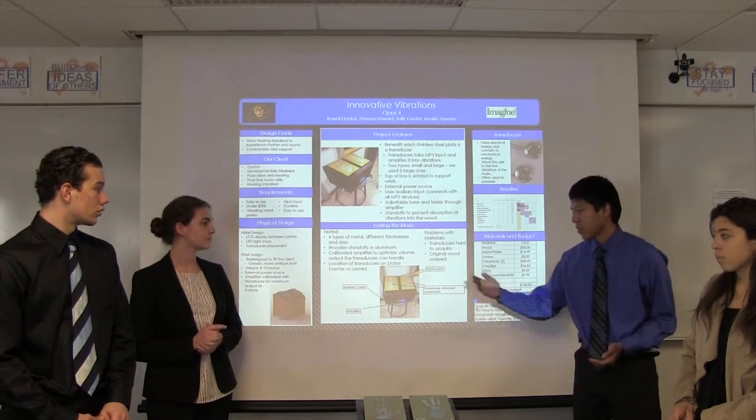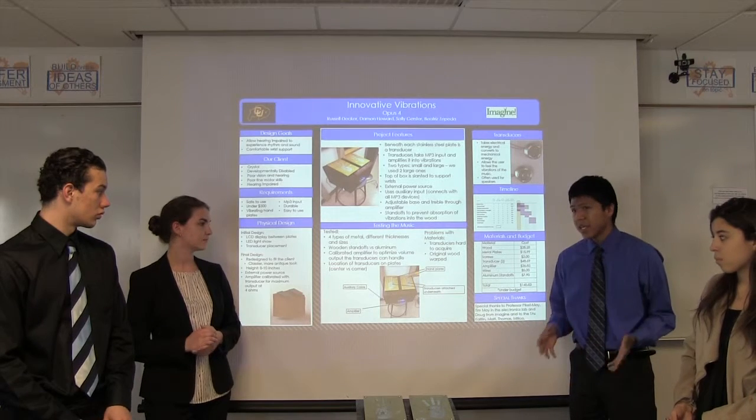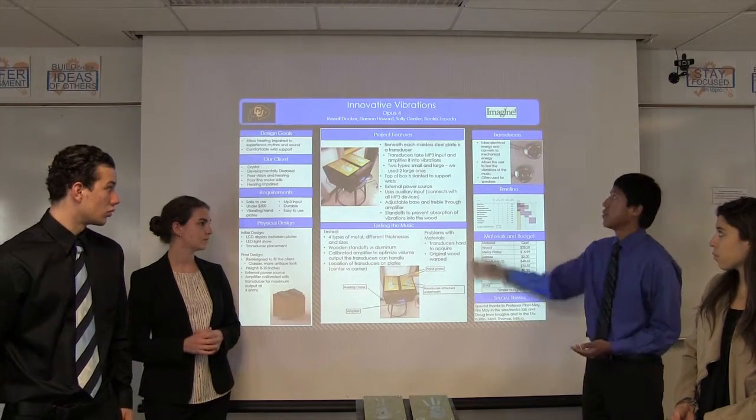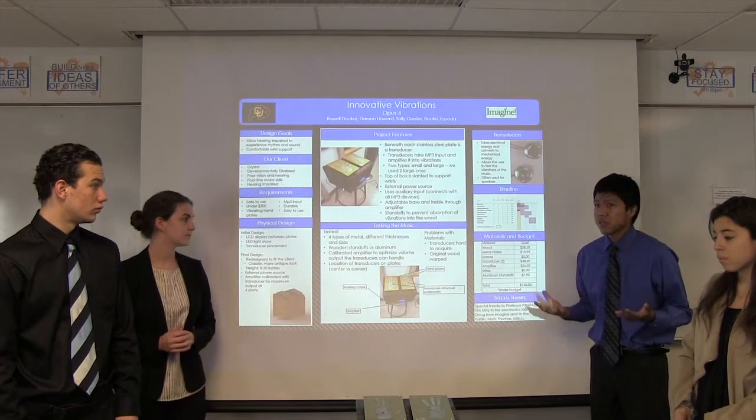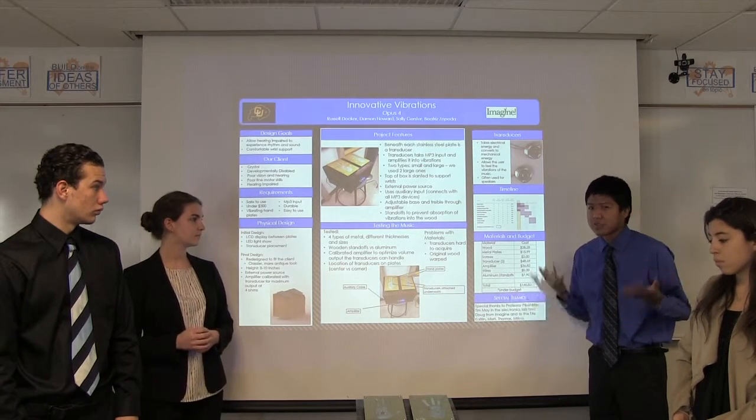We have the hand plates, we have the wind box, we have the amplifier, but the main key component of our project would have to be the transducers. And just to give some background knowledge on the transducers, because engineering has so many things, how can you keep track of all of it, really?